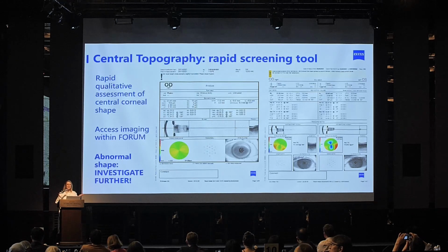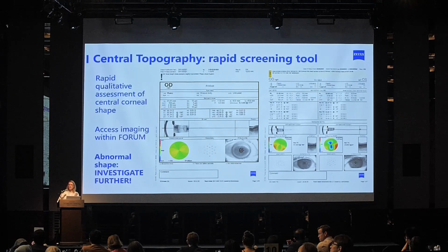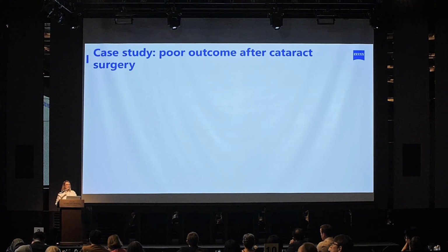So this is a patient I saw late last week who was very interested in a multifocal lens, but clearly those colours are telling you that something is wrong there, and this guy had undiagnosed corneal ectasia. So it already means that you're going to direct the conversation in a certain way.